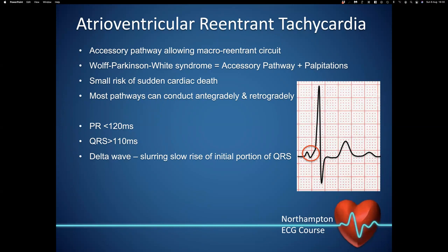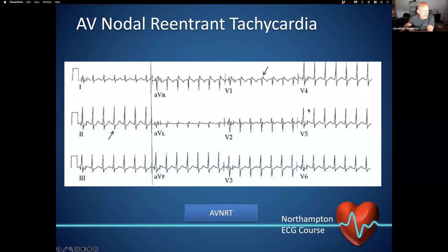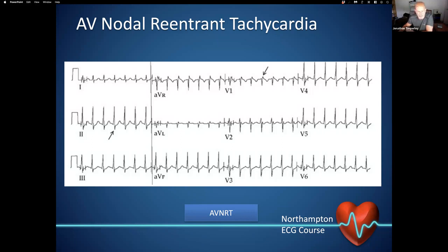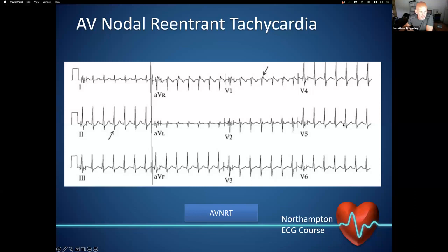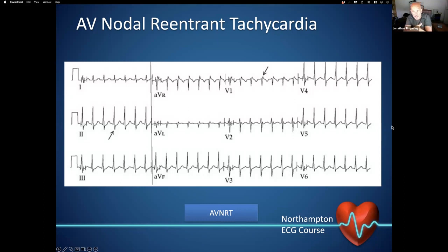Regarding the upsloping ST depression seen on the ECG — at a rate of around 170 beats per minute, seeing upsloping minor lateral ST depression is very common. When we exercise pilots who are young, we see this sort of thing all the time. If you actually measure it at J plus 60 to 80 milliseconds, it will be normal. Although it looks grossly abnormal, when you measure formally from 60 to 80 milliseconds it's actually normal — it's not ischemic. It's very similar to what you see on an exercise test: you can get ST depression in the immediate post-QRS phase, but that is not a marker. You need to go to 60 to 80 milliseconds before making any assessment.